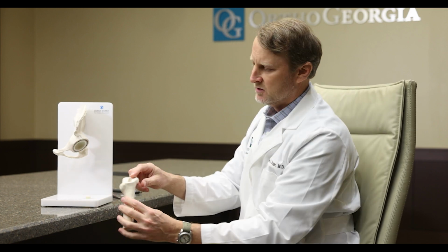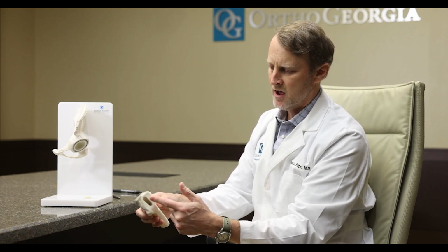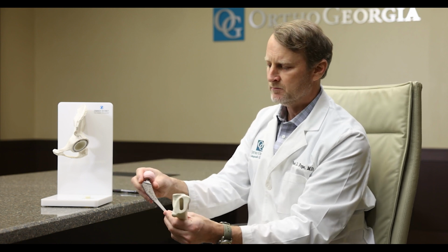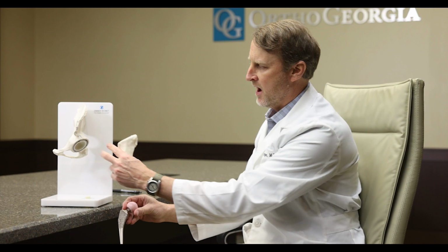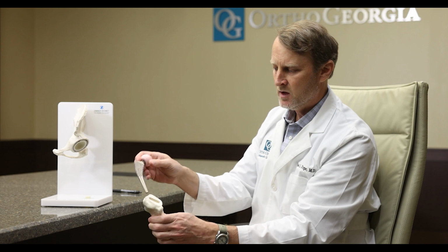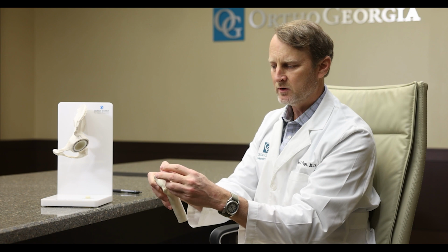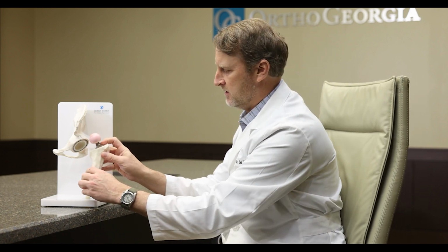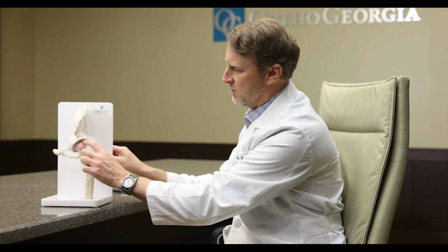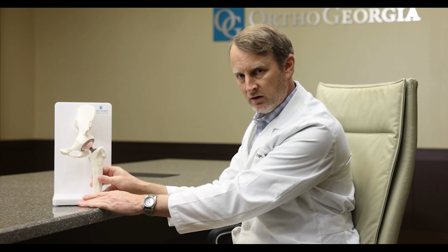Next, attention is turned to the femur, and the cut across the neck gives us access to the intramedullary canal of the femur. And this stem, which is porous coated in the same variety of metal on the backside of the acetabular cup, for the proximal 40% of the stem, is then placed down inside the femoral canal with typically a ceramic ball, and then this ceramic ball will rotate within that polyethylene liner, and that gives you a new ball and socket articulation that typically will alleviate the pain and stiffness encountered in arthritic hips.